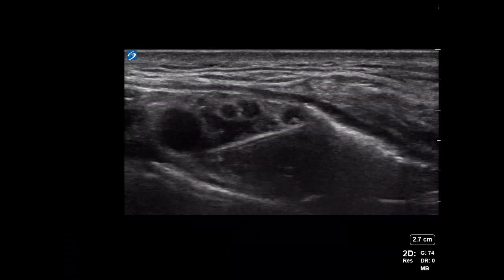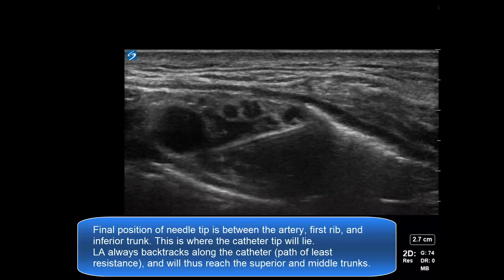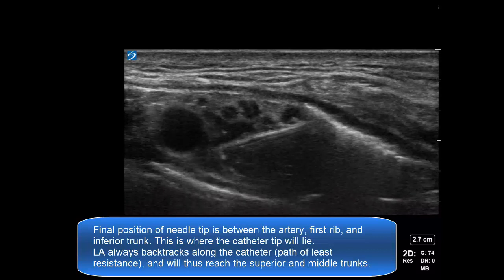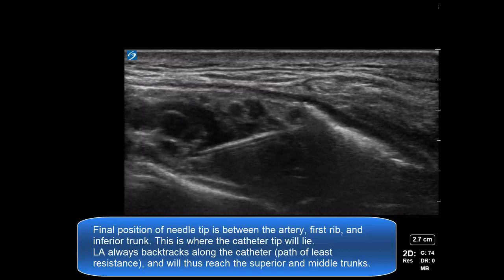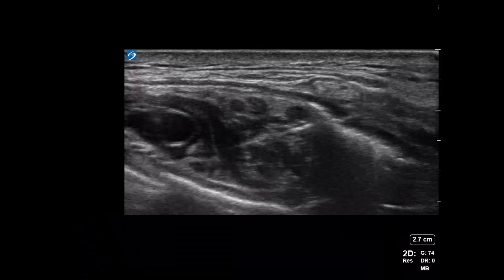The final position of the needle tip is just under the artery, between the artery and the first rib. This is where the catheter tip will lie subsequently when the stylet is removed and switched out for the catheter. The final volumes of local anesthetic are injected here to achieve good spread around all elements of the plexus.